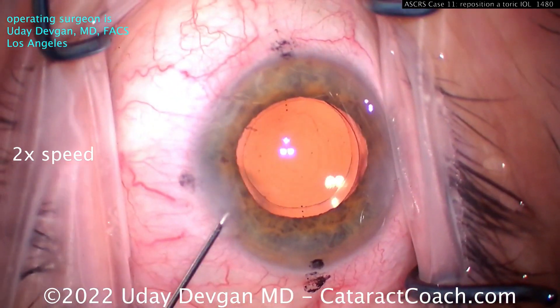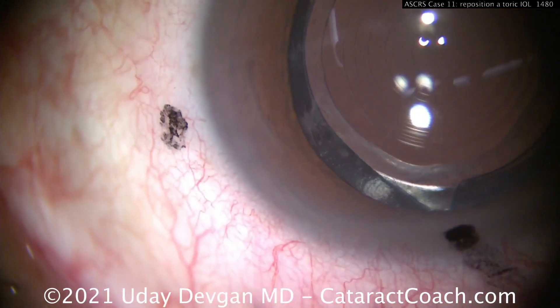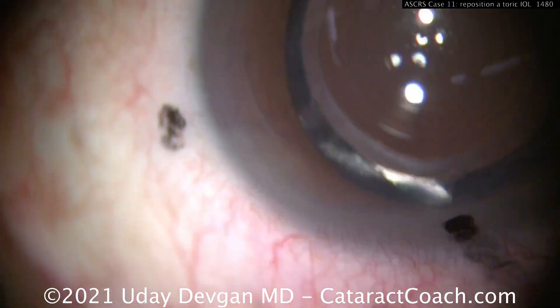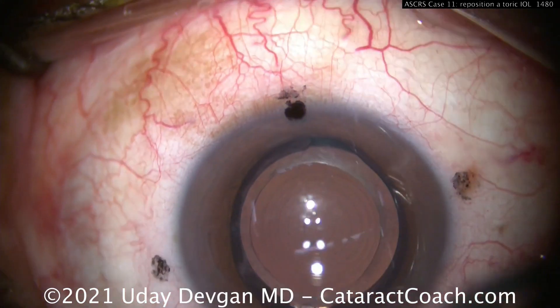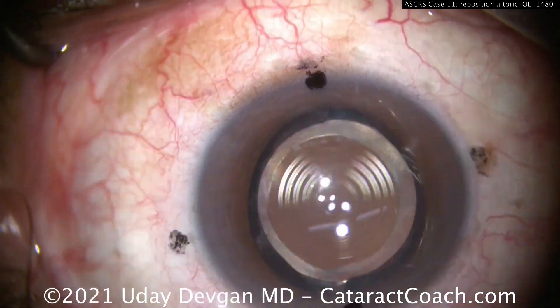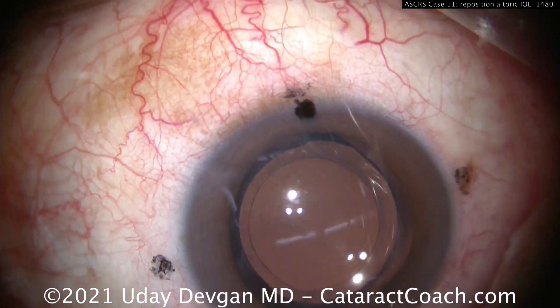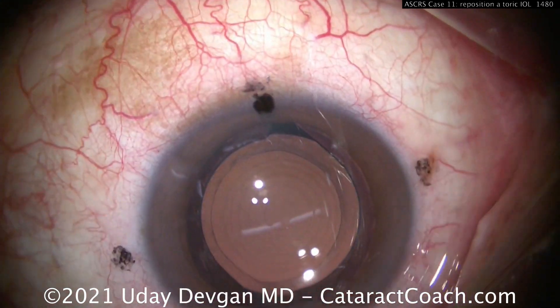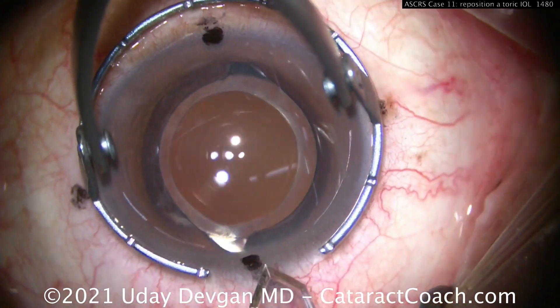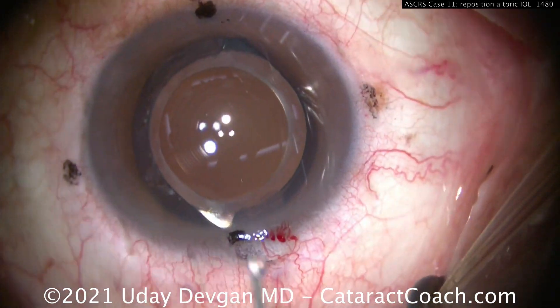Let's show you another one. An interesting case is an IOL exchange where the haptic is stuck. The patient had femtosecond laser-assisted cataract surgery about six or seven months ago and has a trifocal lens that is not tolerated. Making a paracentesis — we're sitting at the superior position. The patient has some residual astigmatism at 90 degrees, so we make our incision at the steep meridian to neutralize that. We're not going to use the old incision.